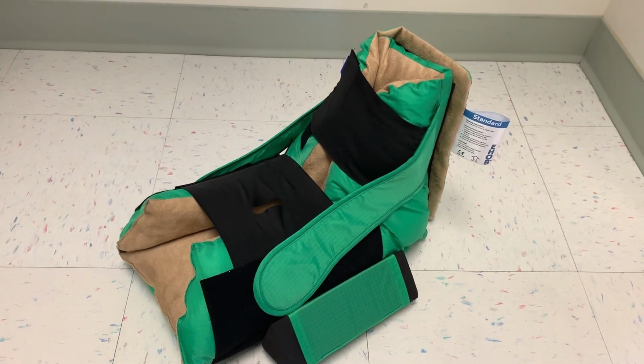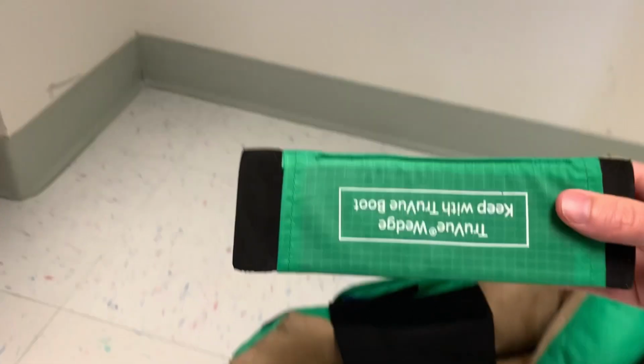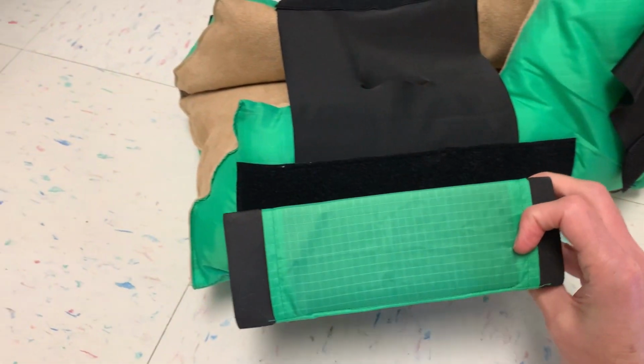I actually will use it on my patients with hip surgery, or if they had like a posterior hip replacement, because it keeps their leg in that neutral position so the foot doesn't pigeon toe. You don't have any internal rotation or external rotation. You can kind of put those little Velcro wedges on the boot so the foot doesn't turn, and that's like a really nice feature to have if you want to just keep that leg in a neutral position.